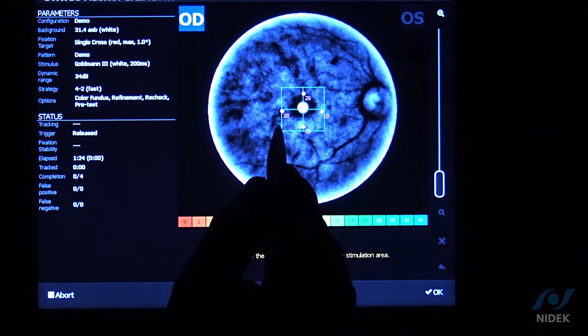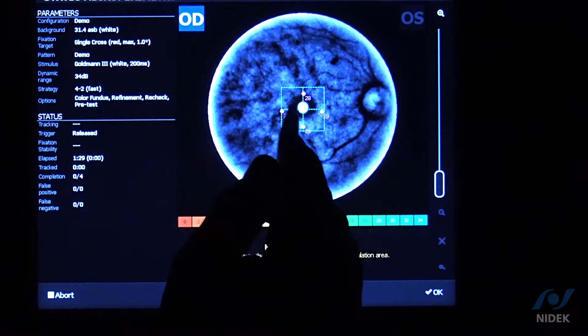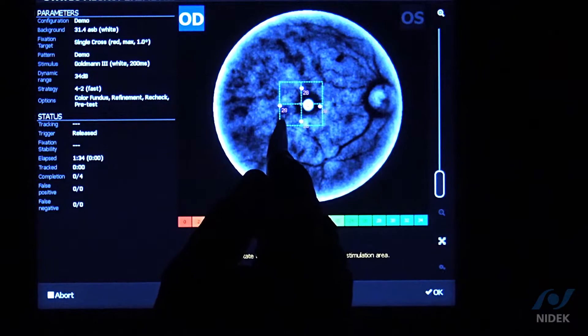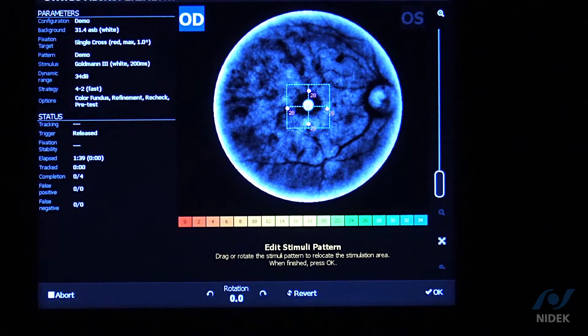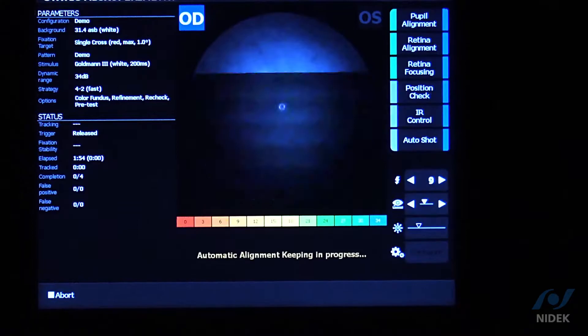Once the coordinates have been completed, this is the demo pattern I created now placed onto the patient's fundus. The square is bisecting the patient's fovea. You can move it eccentrically if you'd like, or leave it at the default. Now we're going to start the exam — have the patient place their thumb on the trigger and tell them they're going to see different levels of light, dark and bright. If you saw it, press the button. We'll start in three, two, one — click OK.